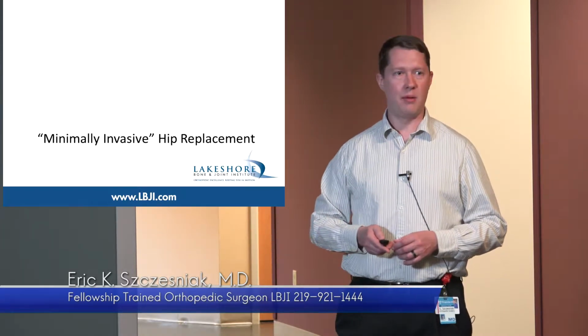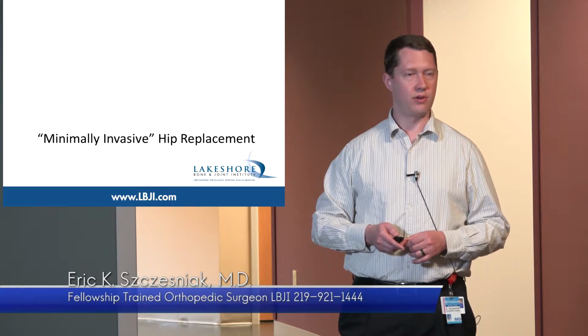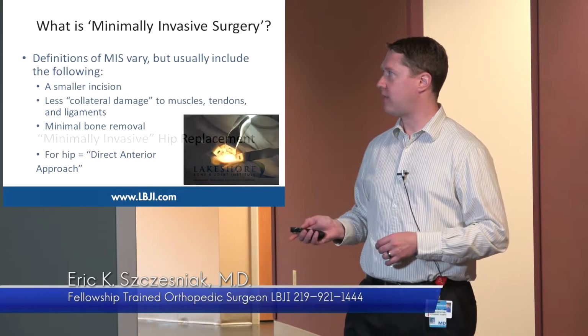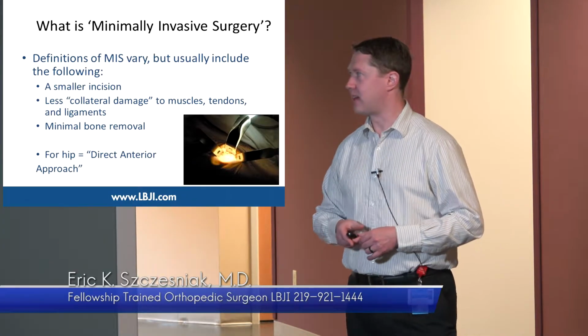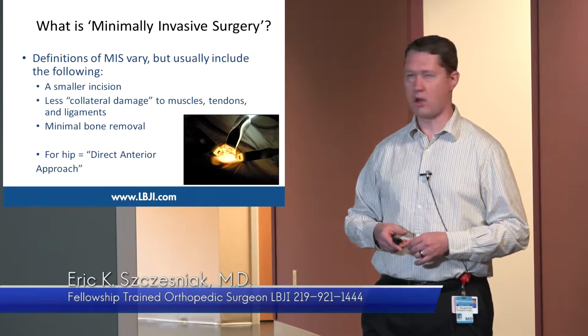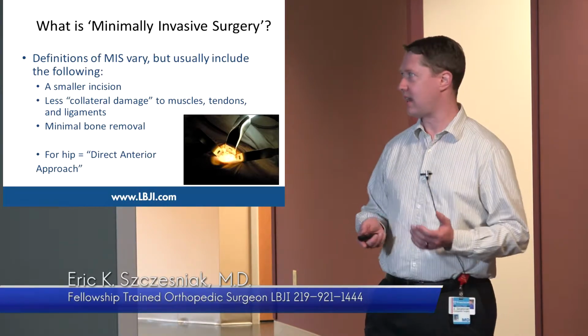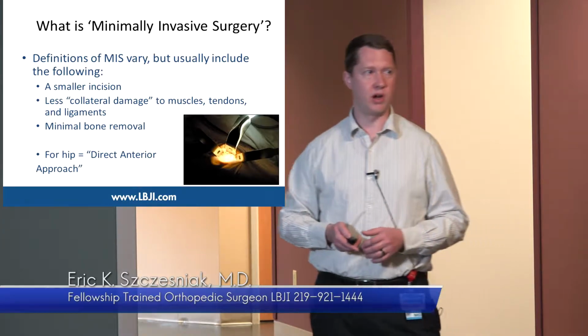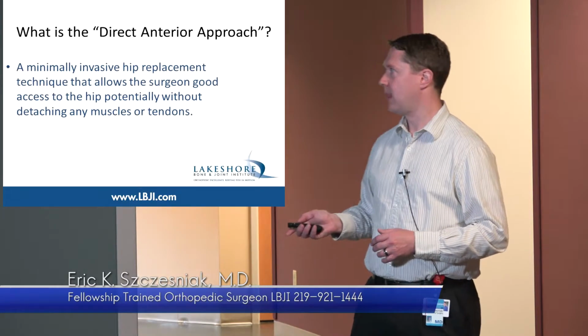One of the most common things asked about in current trends over the last decade is the, quote, minimally invasive hip replacement. In general, minimally invasive doesn't have a clear definition, but it implies you have smaller incisions, less collateral damage, so less cutting of muscles and tendons, less bone removal. And for the hip, it typically refers to what's called a direct anterior approach.